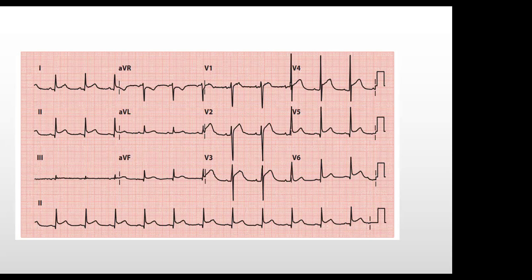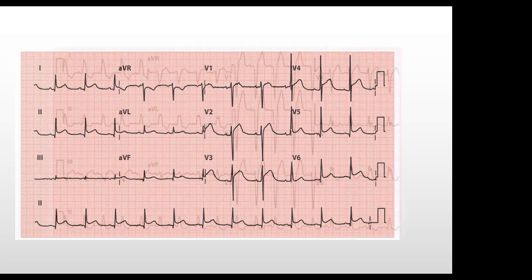So in this case, it's likely to be acute pericarditis. Yeah, agree with you. Acute pericarditis.